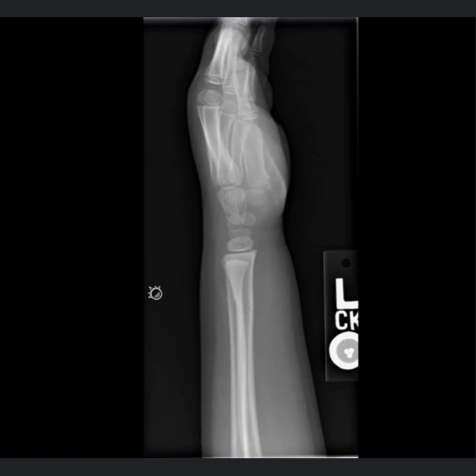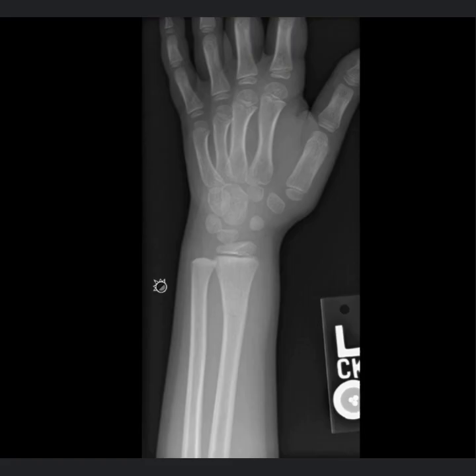I would say the more proximal the fractures are, the older the patient is, the more we're trying to hold reduction, and we may go to a long arm cast in some of these patients. But this patient we placed into a short arm cast. We did try to mold that cast again to try to prevent any further dorsal angulation of the fracture. So after the cast was applied, I did try to perform a little bit of volar molding as well as an interosseous mold, trying to compress that fracture together to hold it in a good position.